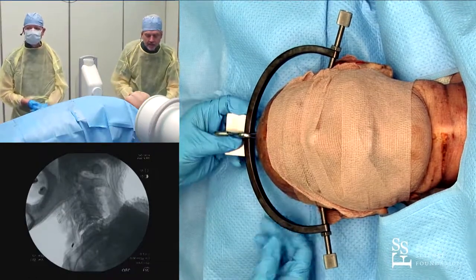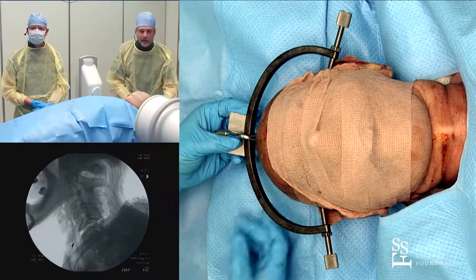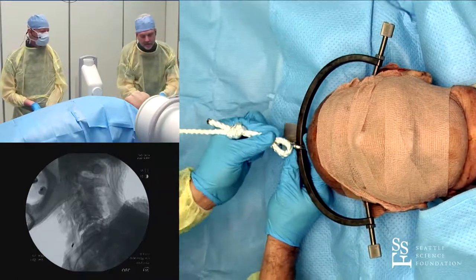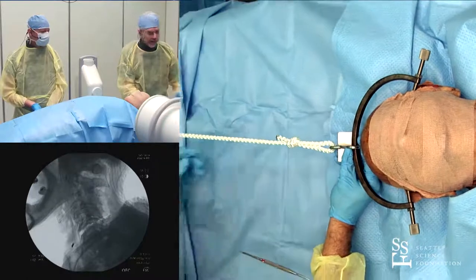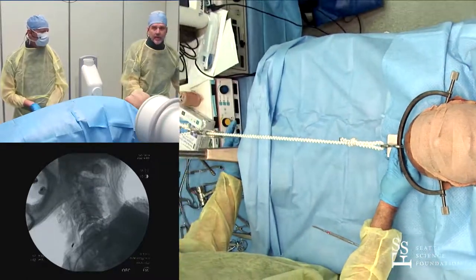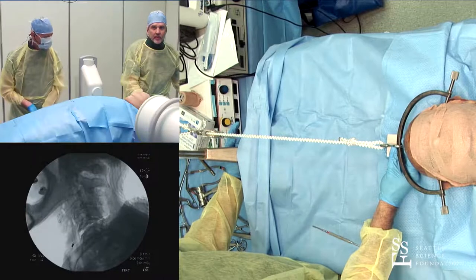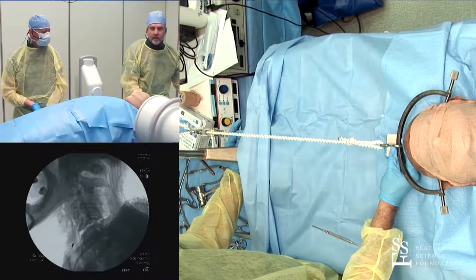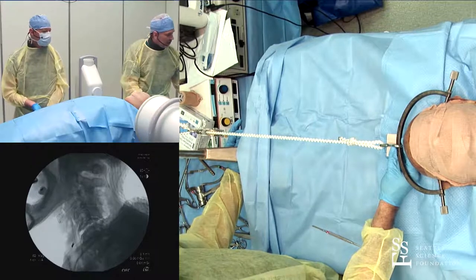The tongs are in place. We'll put a string across the top and use the pulley system at the top of the bed. Make sure the pulley system is set up before you start adding weight — ideally before you even put the tongs on — so you're ready to go immediately.